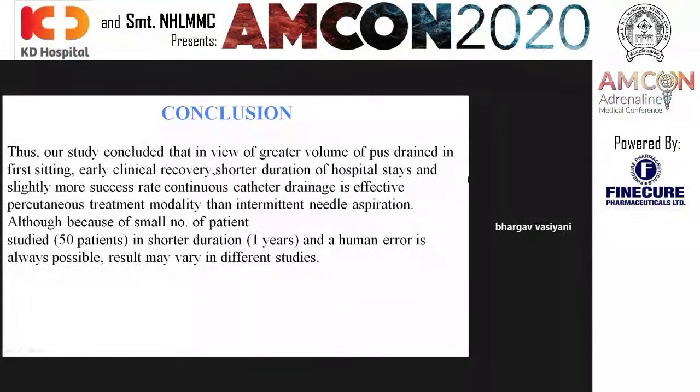Then we can again aspirate the abscess. And sir, in pigtail catheter, we cannot reposition the catheter. We have to reapply the whole pigtail again, sir.